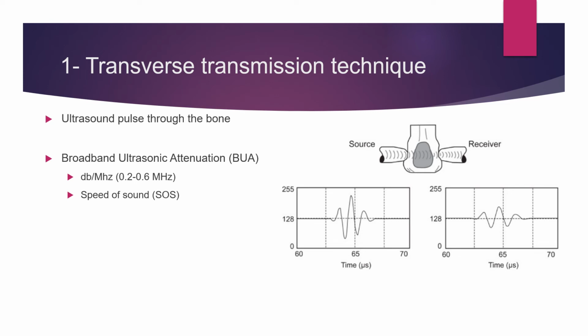This method takes the broadband ultrasonic attenuation, or BUA, expressed in dB per megahertz, and the speed of sound, SOS, of the bone and compares it to a reference medium with known attenuation and speed, like water.